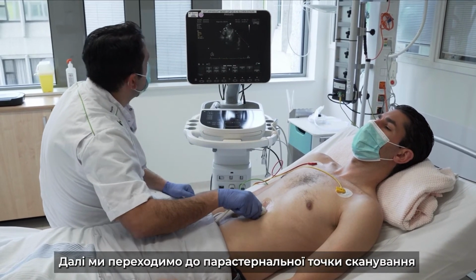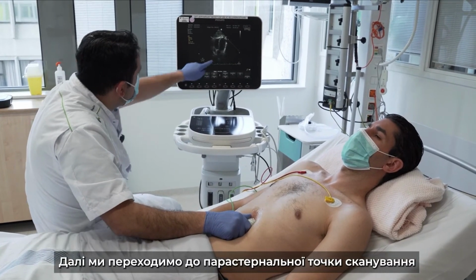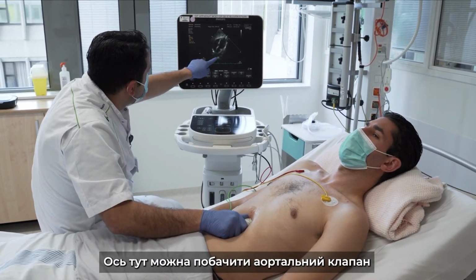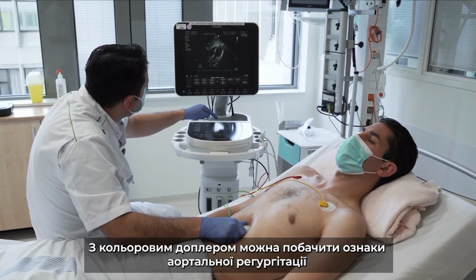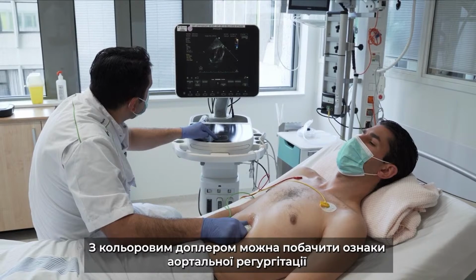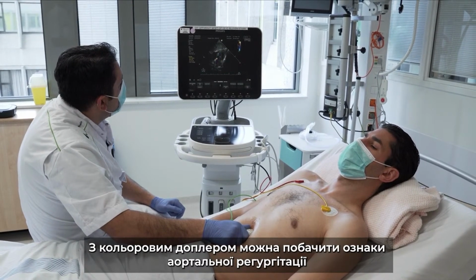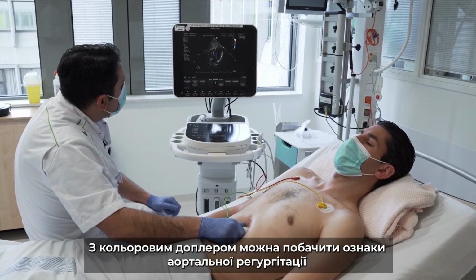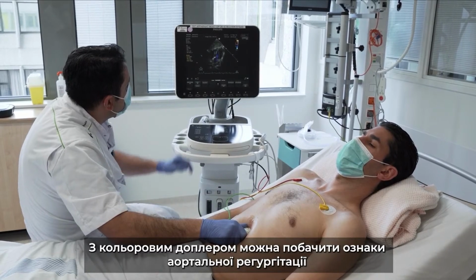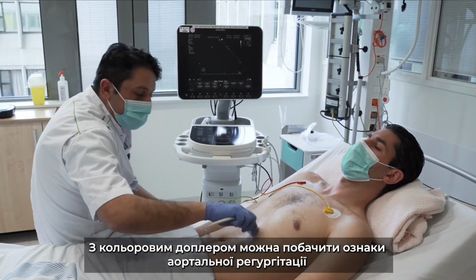I think when next we go to the parasternal window, is that okay? Aortic valve in the subcostal view only. Oh yes, that's nice. Sometimes you can see in color Doppler if there is a sign of aortic regurgitation, you can think about something like aortic dissection. Yes. Okay, we didn't have a sign of pericardial effusion, but it can be an additional window.